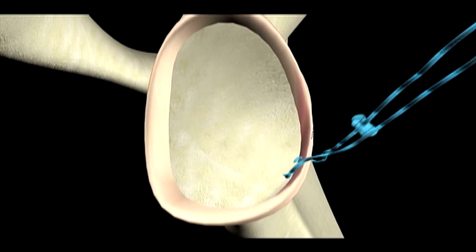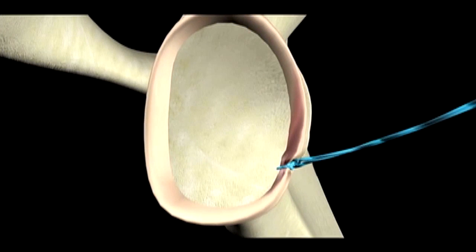The suture is passed through labral tissue. Desired arthroscopic knots are then tied with an open or closed knot pusher.